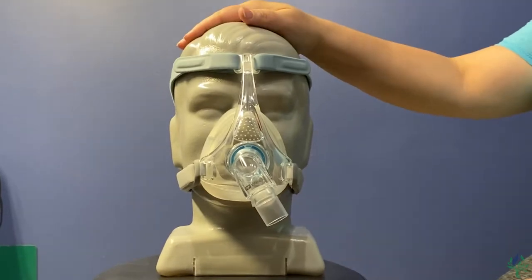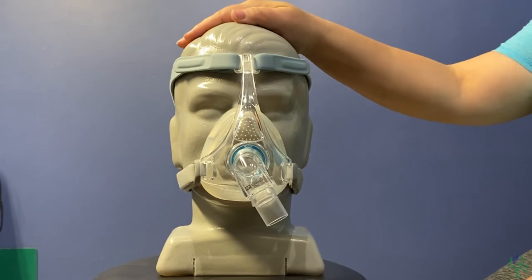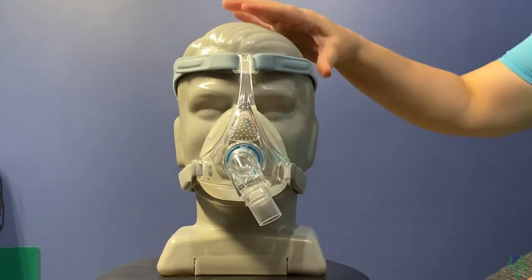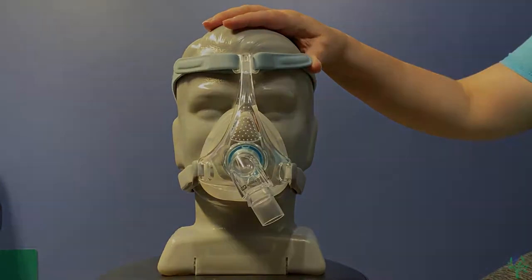Today we're going to talk about the Fisher & Paykel Viterra. I'm going to walk you through how you're going to want to adjust the mask, and then we'll go through how you want to take the mask apart and clean it.